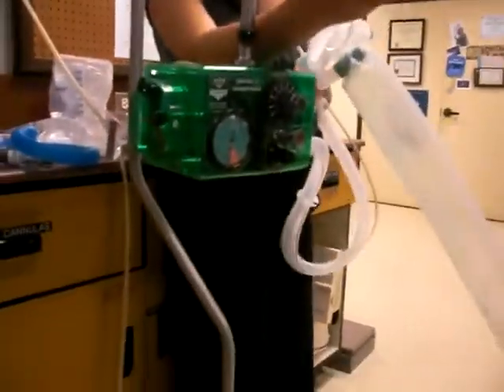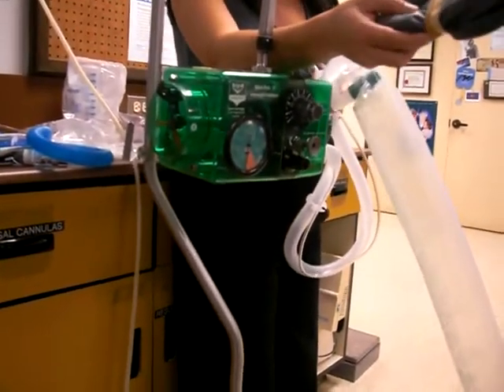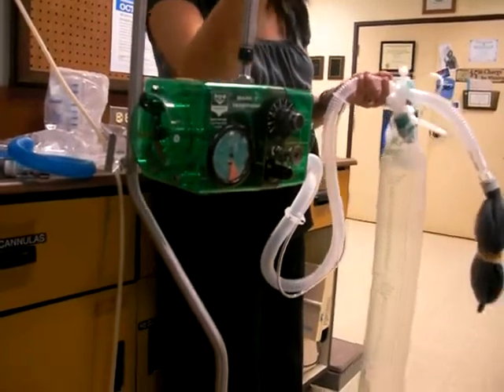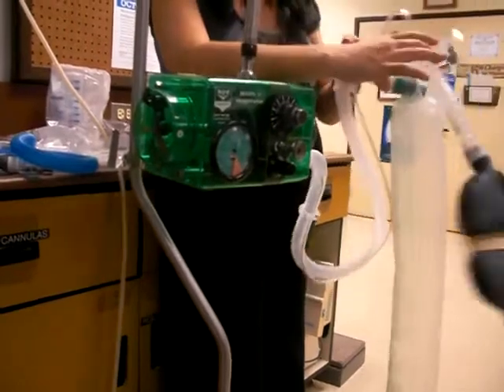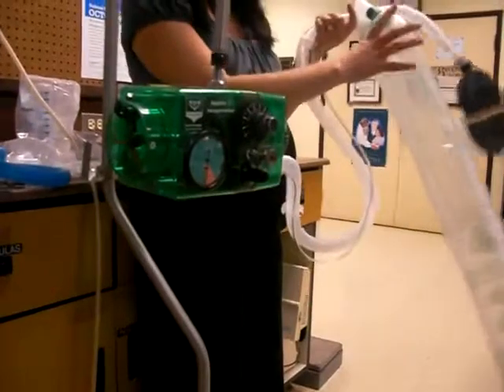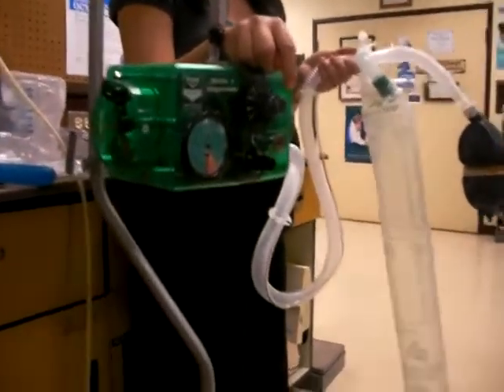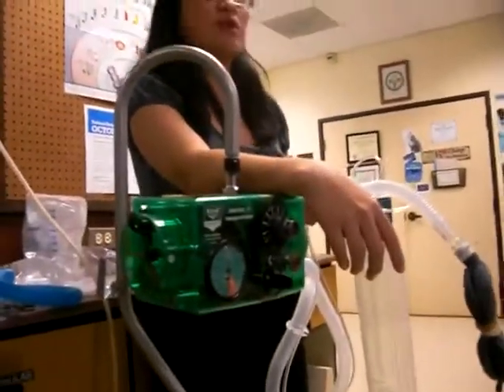But you can see this simulates, there's 3 rubber bands in here. That's a very restricted lung, like someone who has pneumonia, who has atelectasis. It takes that much pressure to get 800. Whereas with Austin earlier, it only took 10 to 15 to get a huge tidal volume because his lungs are compliant. Okay. So if it has to do with tidal volume, you touch the pressure first. If the tidal volume was 800 earlier, but the I time was too short, then you would adjust the flow. Okay? Now sensitivity, he already demonstrated that earlier.